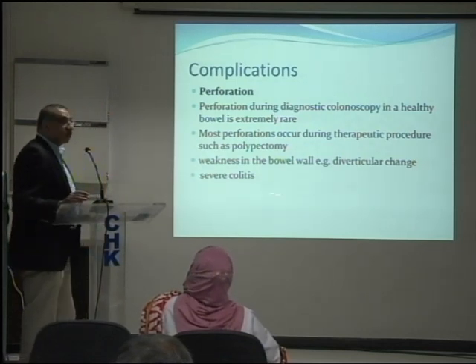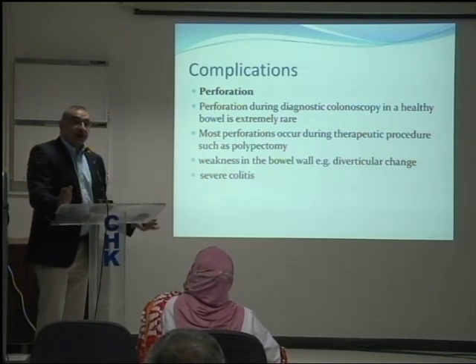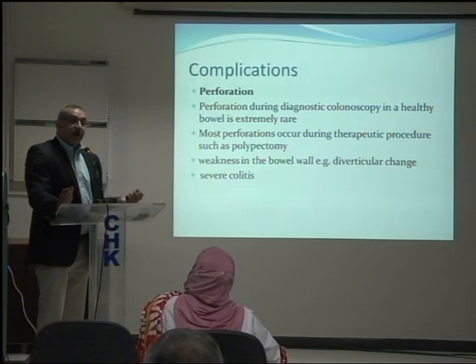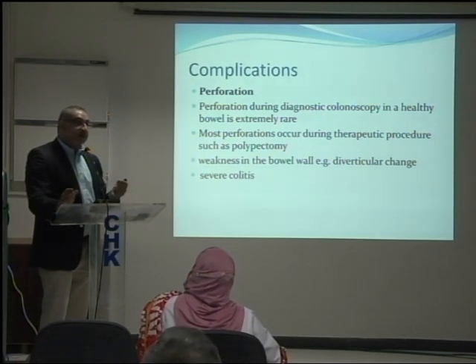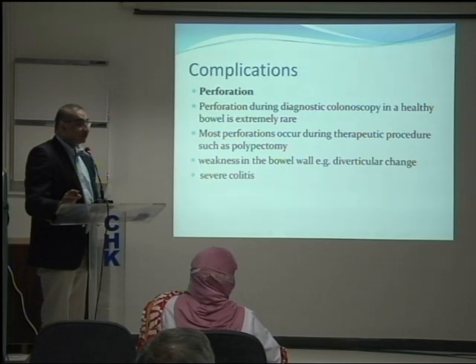And in patients with severe colitis, there is a high risk of complication. So again, we do not do a complete colonoscopy in acute severe colitis. What's the point of doing it? Because if you've got active acute fulminant colitis, whether it is left-sided colitis, pancolitis, or whatever, the treatment and management is exactly the same. Anyone seen perforation, colonoscopic perforation, anyone?